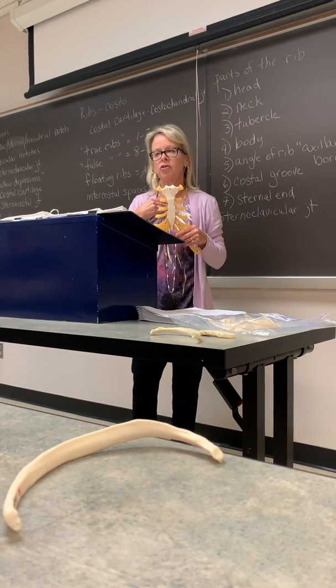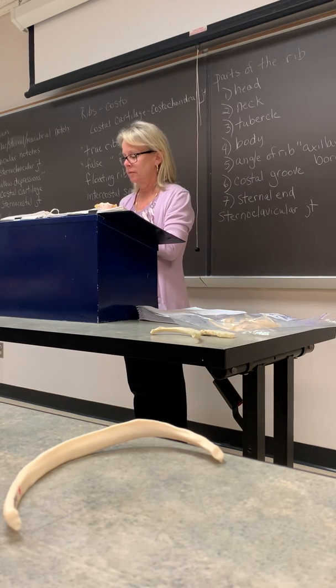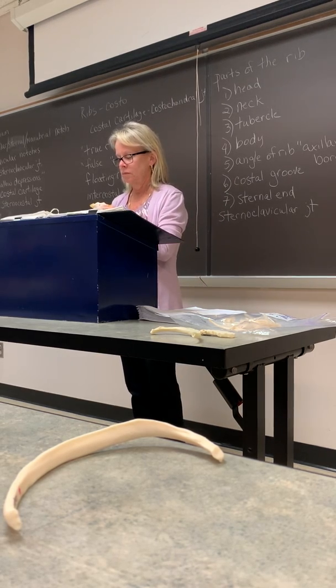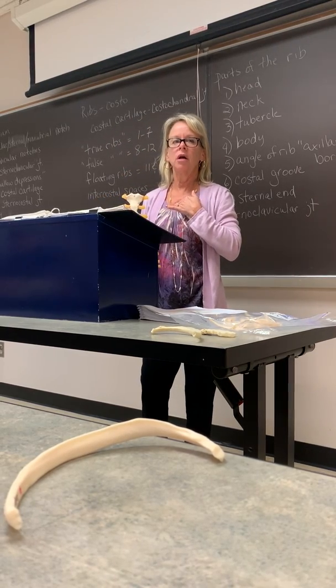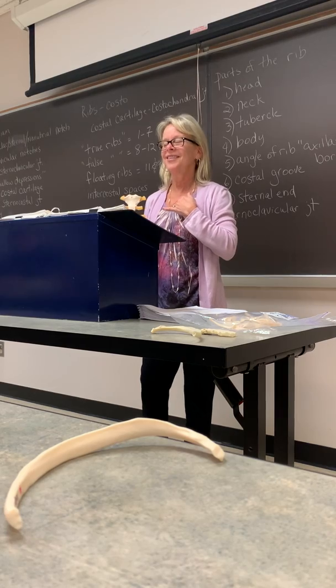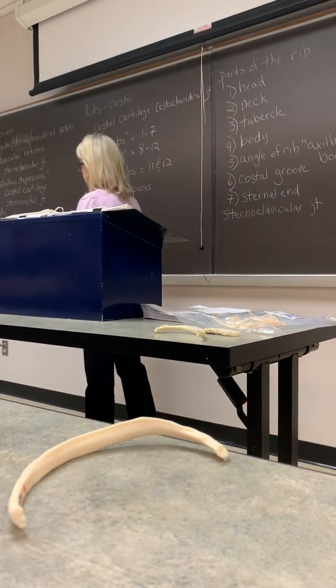Okay, if you remember, you can also palpate the sternal angle. Do you remember its location? T4? T4, T5. The sternal angle is about T4, T5.